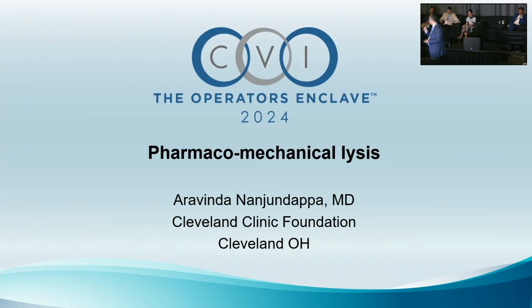All right, any questions? I'm sorry, they attempted first thrombectomy, is that right? The first time, they tried to just put another stent. Okay, I think that this is a perfect case for lysis first, because the less intense the presentation, I think we have the opportunity for lysis. If this was ischemia 2B, then I would want something with immediate action, mechanical thrombectomy. But if it's 2A, in this case, it's not even 2A, it's probably 1.